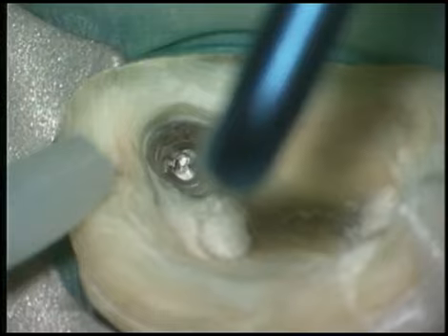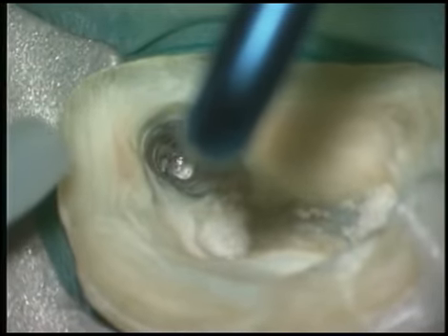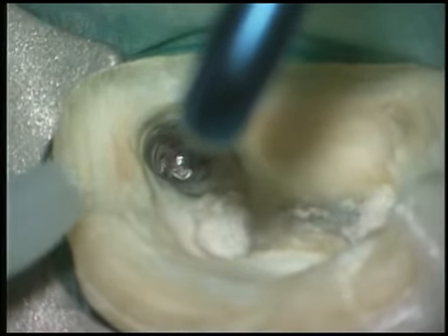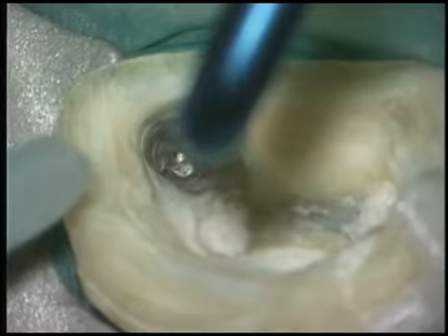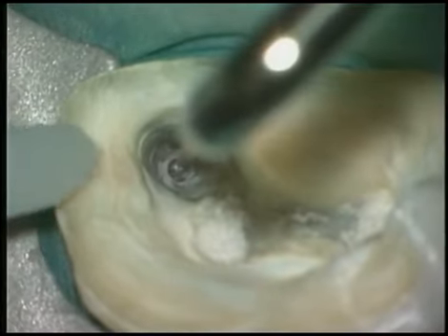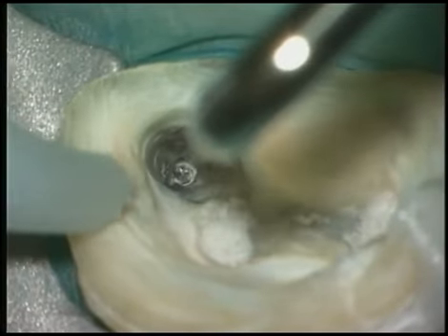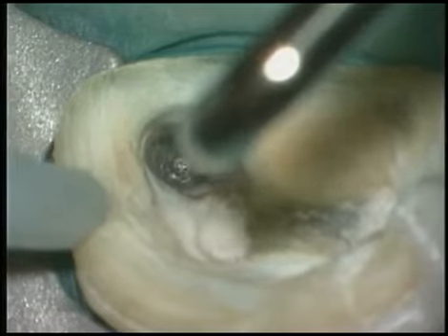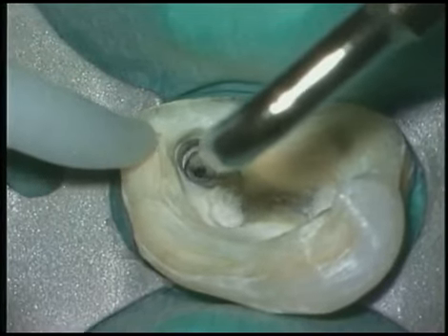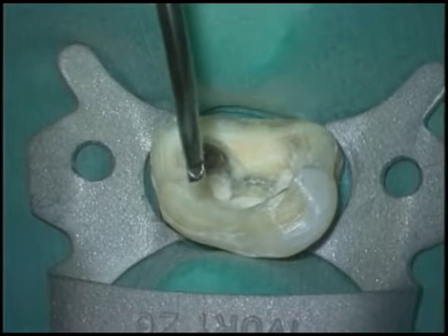Here we employ an ultrasonic titanium endo number 7. Keep the instrument's tip in intimate contact with the broken obstruction. Move the instrument in a counterclockwise rotation to encourage unwinding. Oftentimes, to get further around the instrument and deeper, revert to a zirconium nitride number 5. Ultrasonics is continued, but sometimes, even though the instrument is moving, it still resists removal.